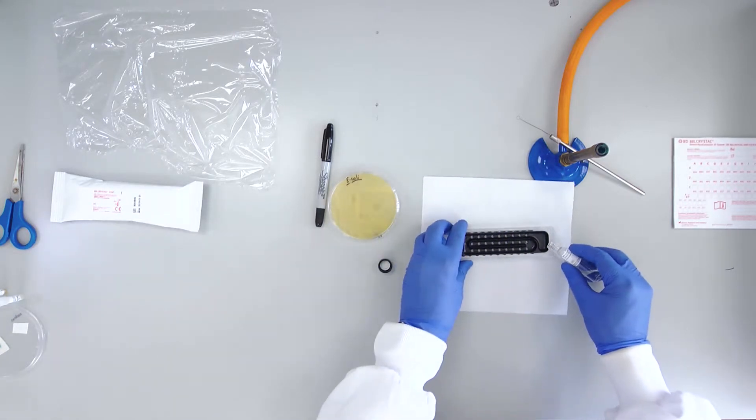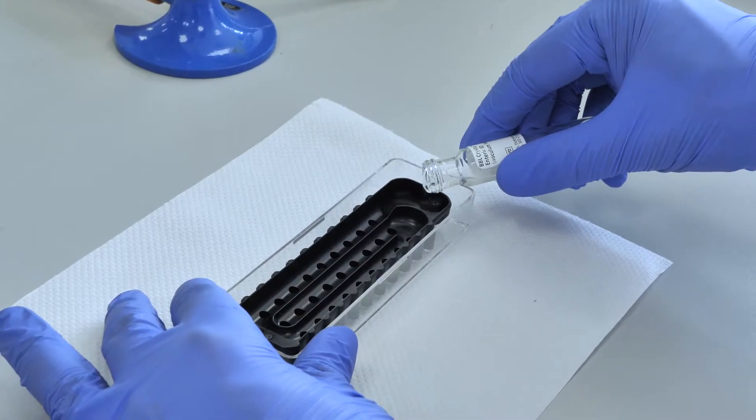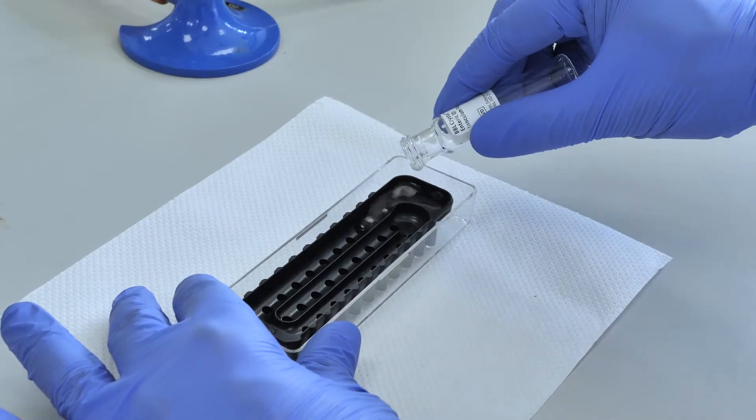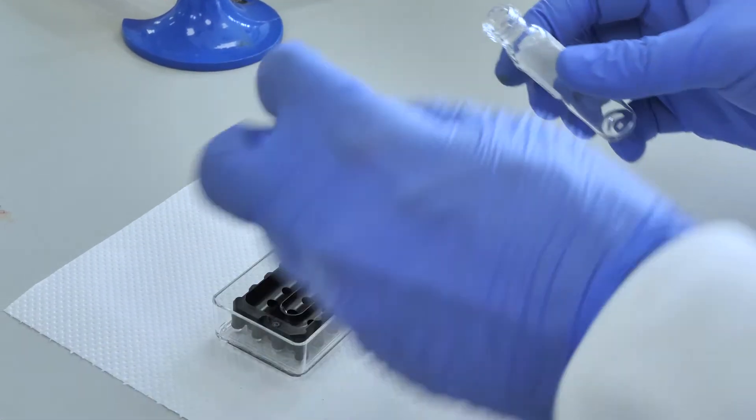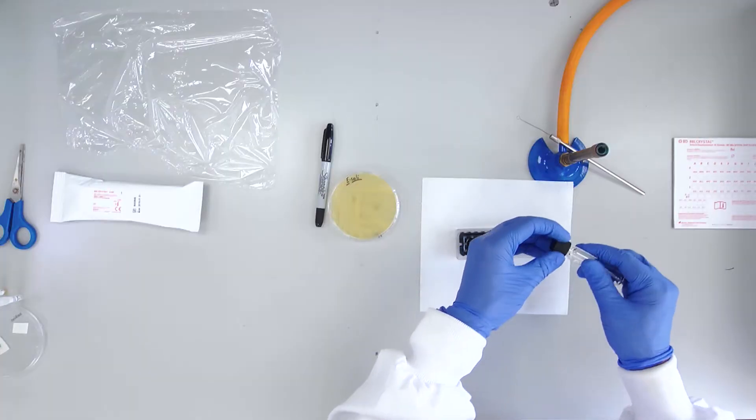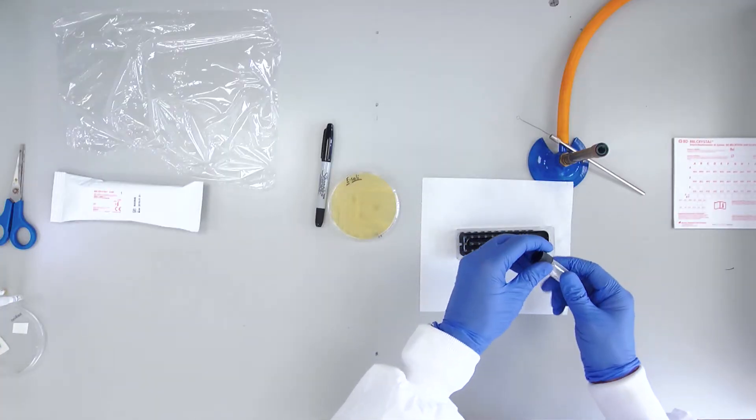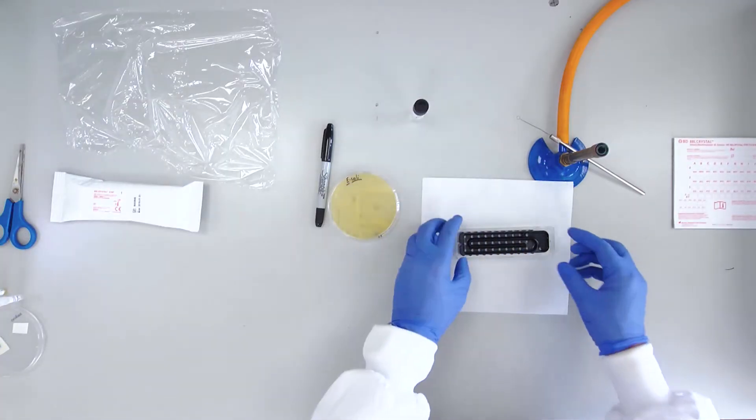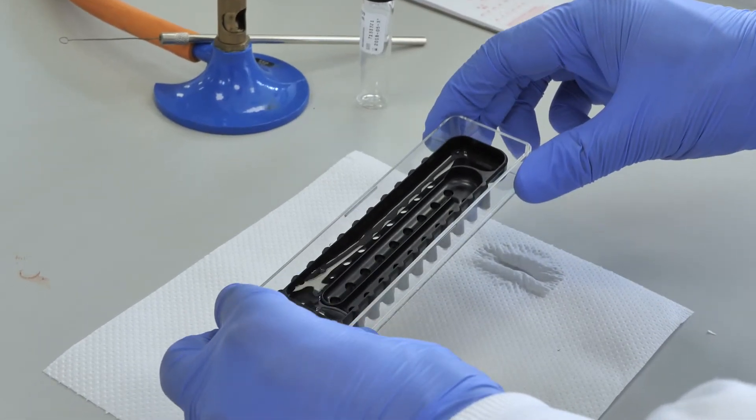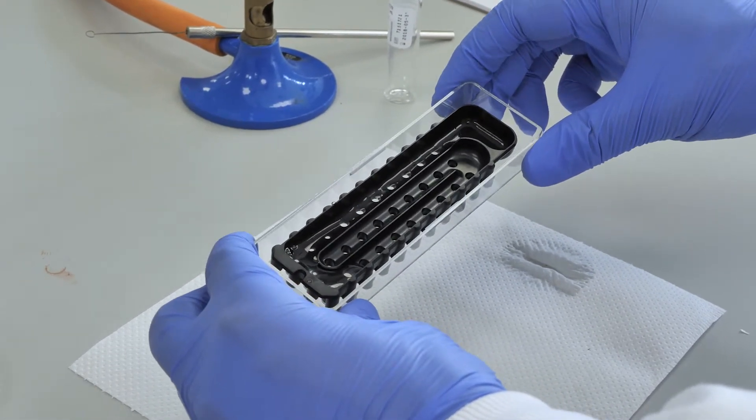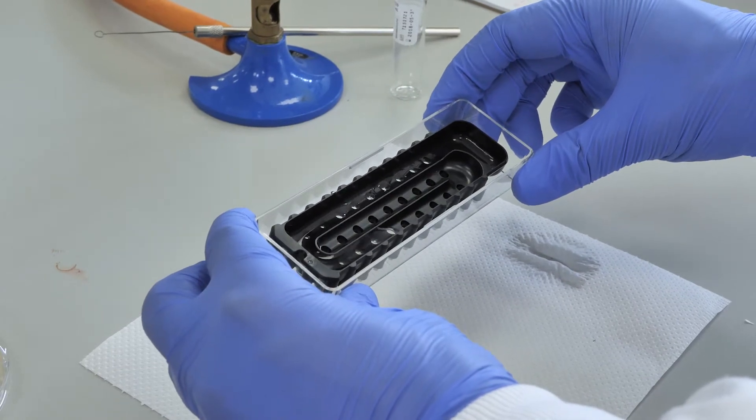Pour the contents of the inoculum into the target area of the base. Slowly roll the inoculum liquid gently along the tracks until all of the wells are filled.